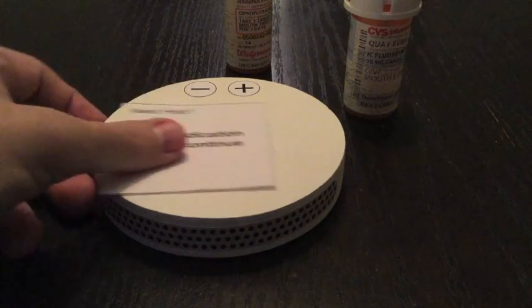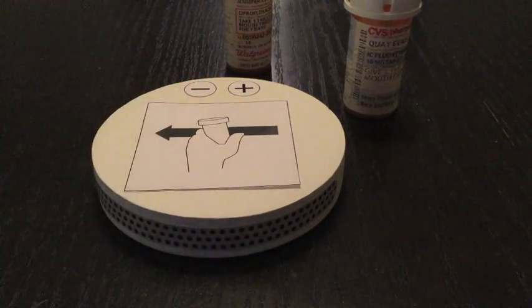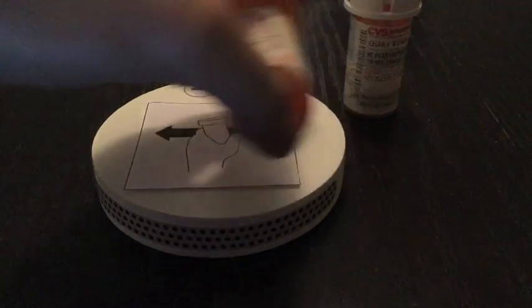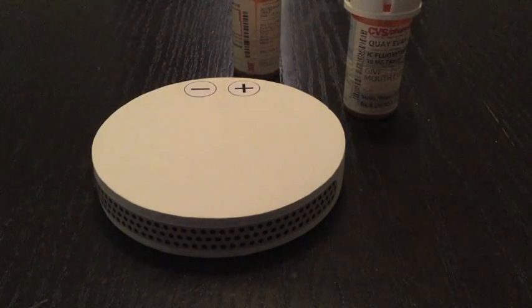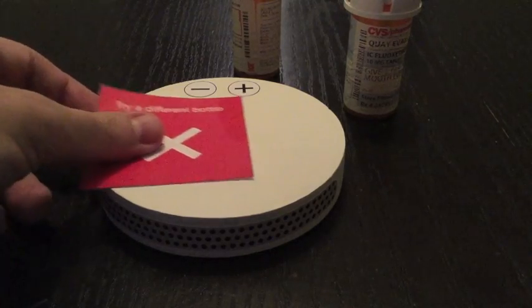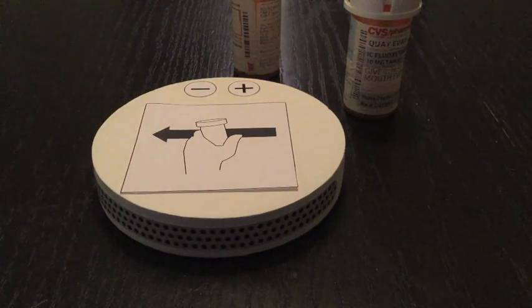After a minute with no activity, the device displays a graphic to try to help inform the user how to do this. The user takes their medication, passes it over the scanner. If the medication is incorrect, the device warns them and asks them to try a different bottle. Again, displaying the graphic showing them how.